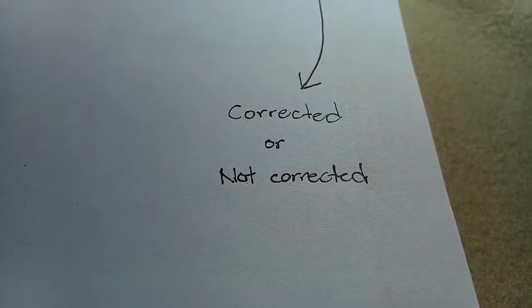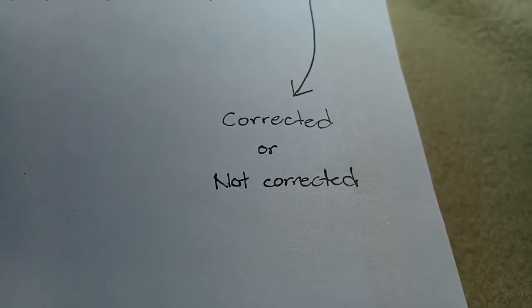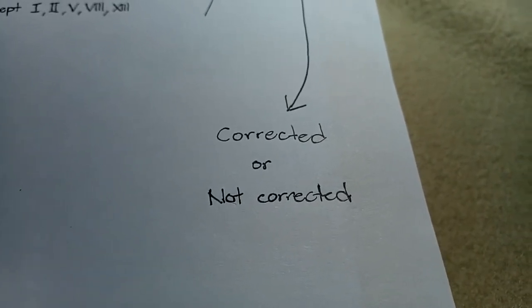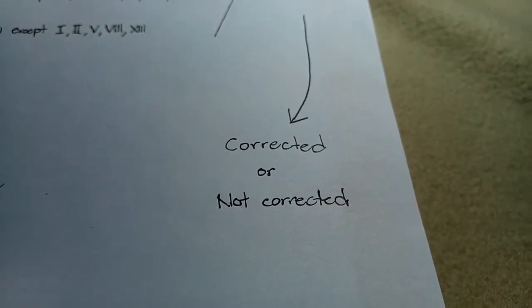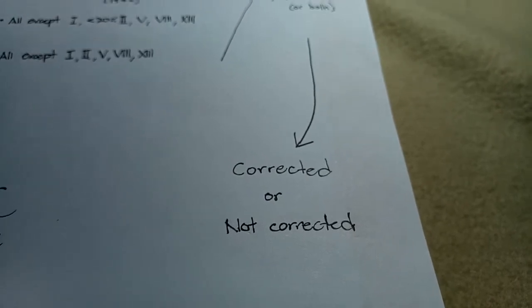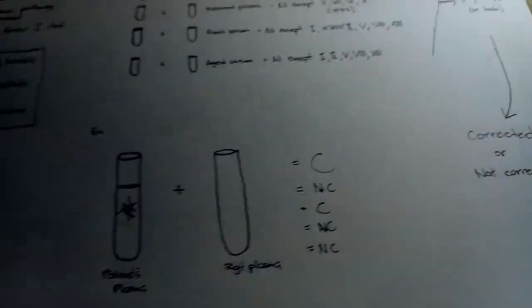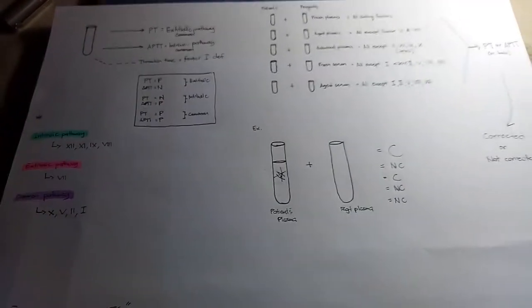Paano ba malalaman? Prolong. Normal. Di ba? Meaning kasi ng prolong, meaning na prolong yung time kasi may deficient or may missing na coagulation factors. Okay? So, ayan po yung sa laboratory part.